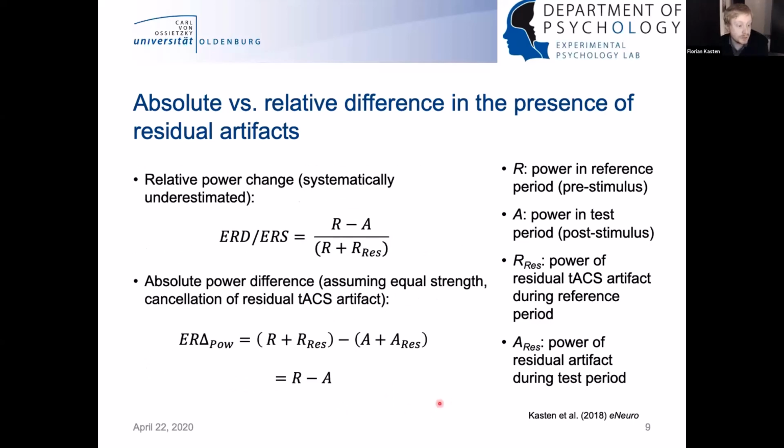So for this study, instead of doing this, we decided to go for the absolute difference, where we would hope that under the assumption that in both periods the artifact is approximately the same, these would cancel out and give us more robust results.